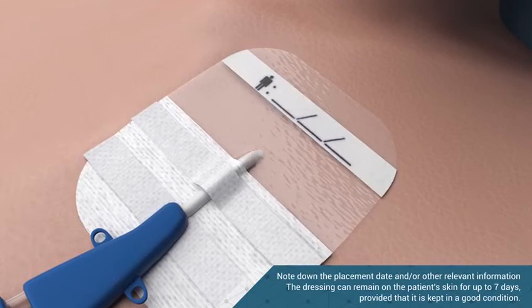To finish, note down the placement date and other relevant information on the ID label and place it next to the dressing.